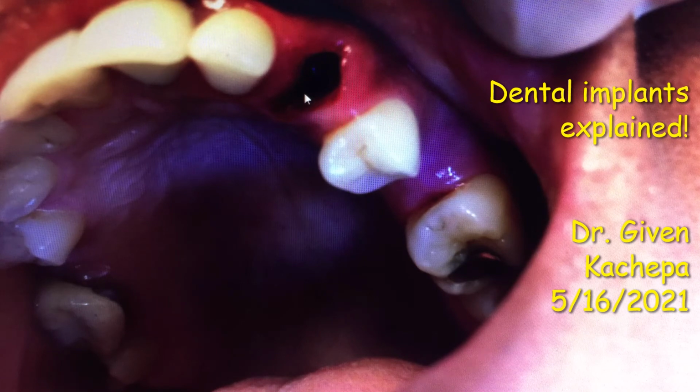Once I place the implant, I like to pack it with some synthetic bone in the crevices where there might be some areas that are not completely filled by the implant. And then we suture on top of that. Then I like to see the patient 1 week after I've placed the implant, and then 2 weeks after, and then a month, and then 6 months later, after the implant is completely healed, we start the process to make a crown on top of that implant.